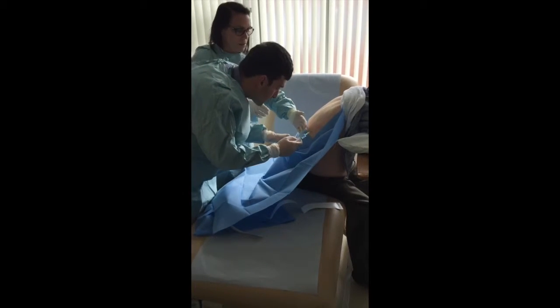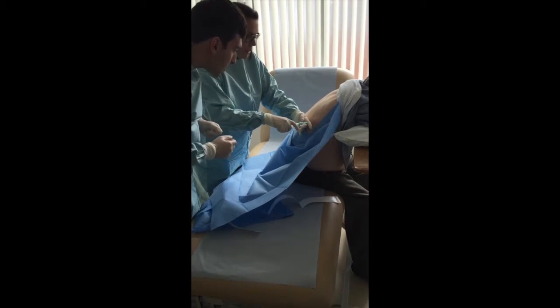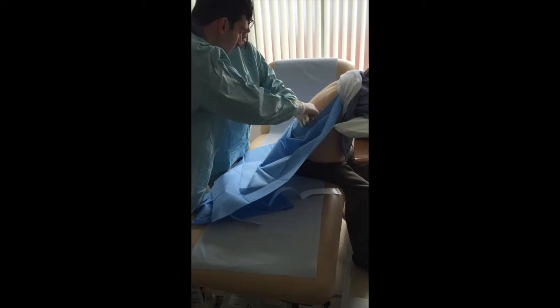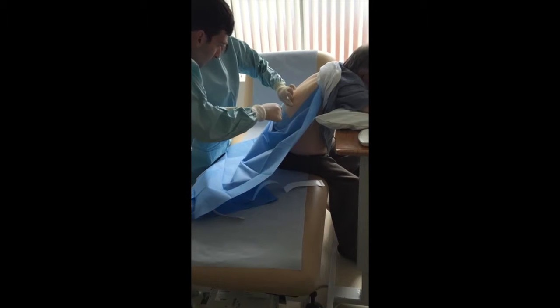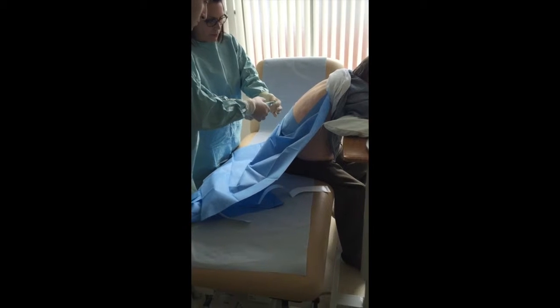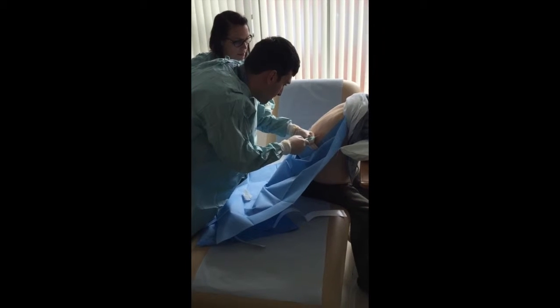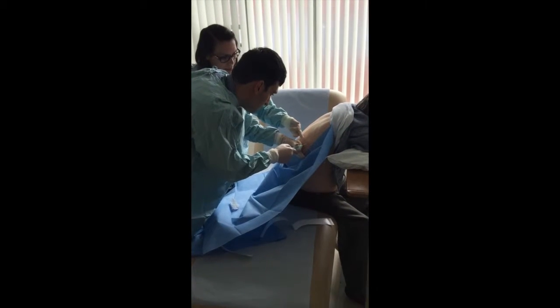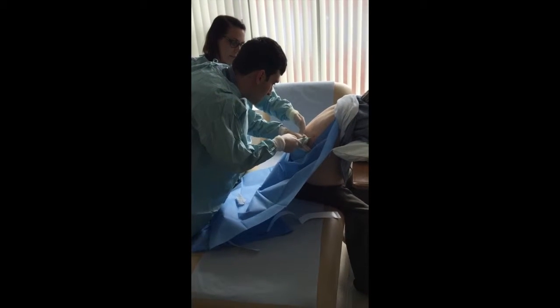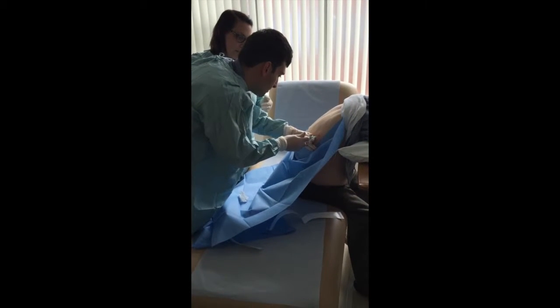Okay, great. So at this bit, it's really helpful if you get your hand against the chest wall. And you're going to go in exactly the same angle. And as you're going through, you're going to be aspirating and infiltrating. So put your hand against the wall. And just go exactly the same place that you've gone into, so you know that's where we've scanned. A little bit more pressure because this needle gauge is slightly bigger, isn't it? So you're going to be aspirating and infiltrating as you go.